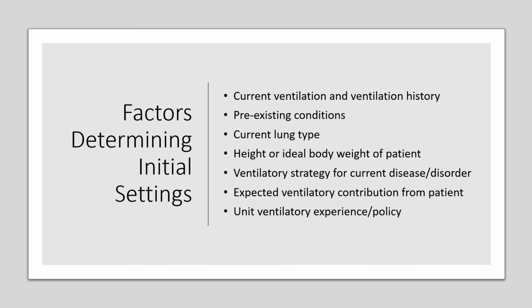Pre-existing conditions play a large part of how you would start to ventilate a patient. The classic things in paediatrics which affect us are things like chronic lung disease and neurological disorders, and things like kyphoscoliosis and the restrictive component that puts on ventilation. So for someone who may have normal lungs, or for whatever lung type they have, if they've got these pre-existing conditions, those conditions are going to change the way that you approach it.